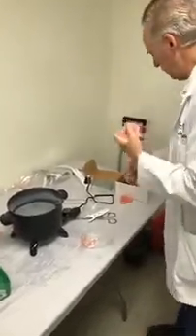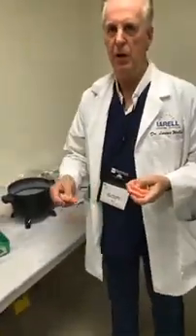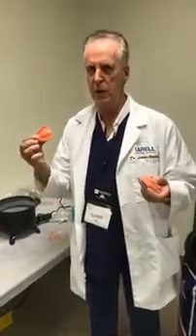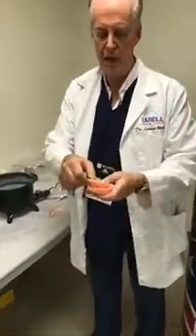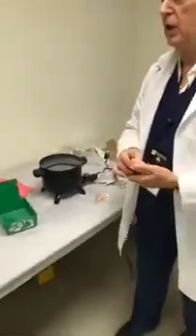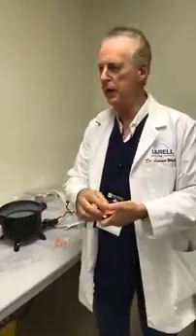So you basically get the approximate fit in the lab, and then you custom fit with the reline in the patient's mouth. That same template was adjusted on the model, taken to the mouth, and in this case we used the sample model and created the custom reline to create the final denture. It's adjusted on the inside, it's adjusted on the outside for comfort. It's set for the patient's bite and works very well that way.